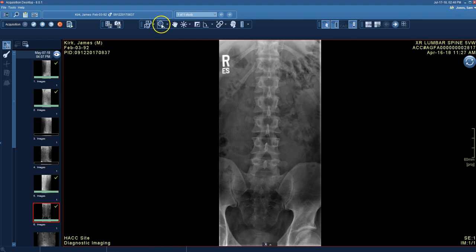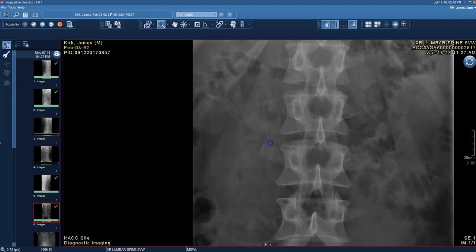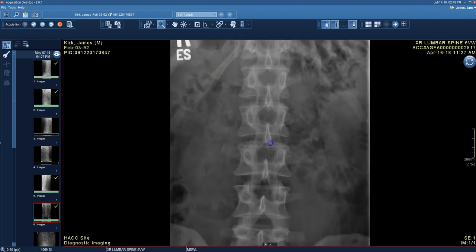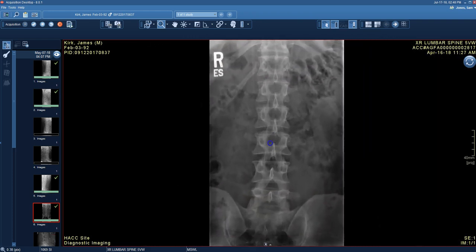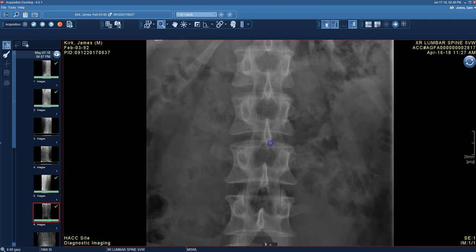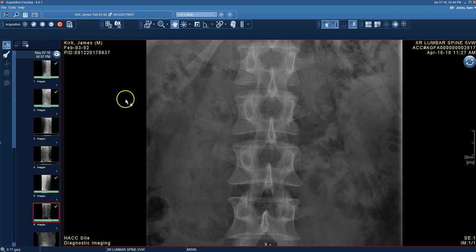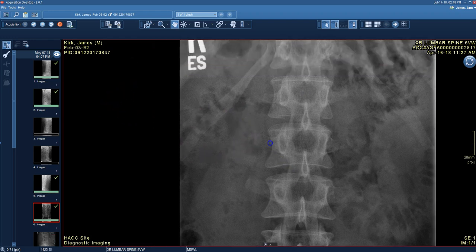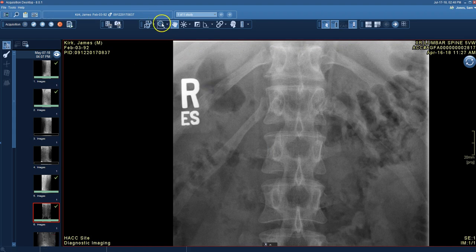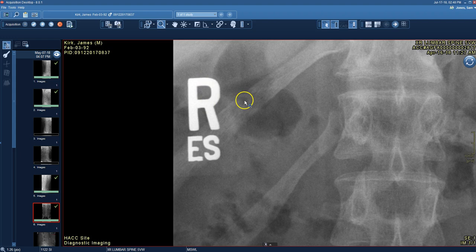Next is zoom. Click the magnifying glass icon with a single left-click, then come down to the image, hold the left mouse button, and move the mouse up and down vertically to zoom. I've now zoomed the right marker off the screen, so I'll use the pan tool. Click the pan tool — the hand icon — and the pointer now has the hand attached. I can pan the image over to bring that marker into view.